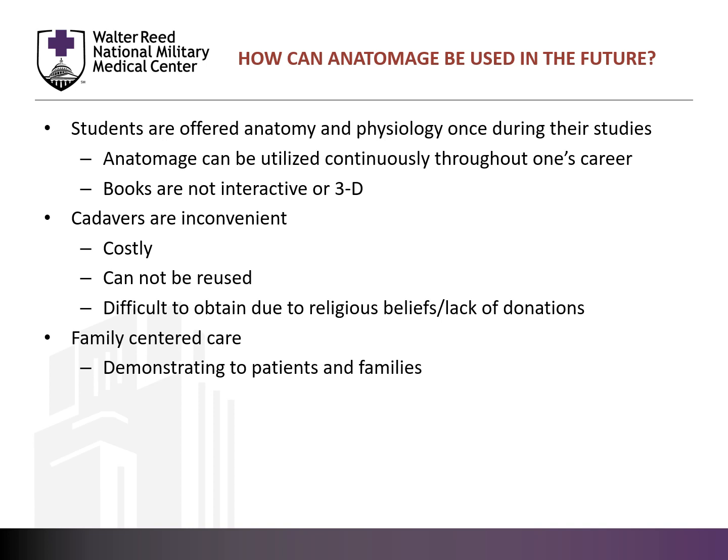It can be utilized as demonstration to patients and families so that they can have a better understanding of their current health situation. As more pathological conditions can be introduced into the software, healthcare workers may be able to add specific details as they apply to their patient and make medical and surgical plans accordingly.